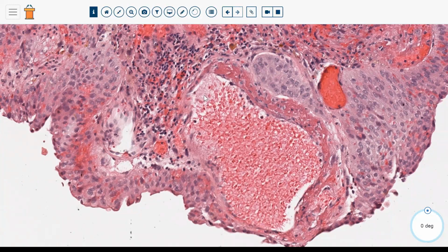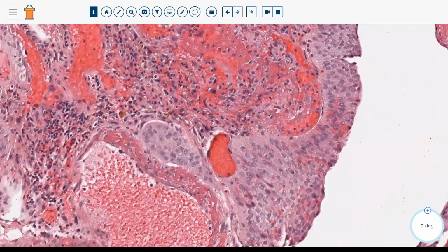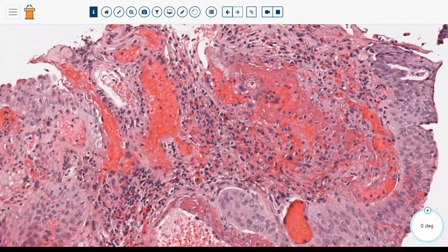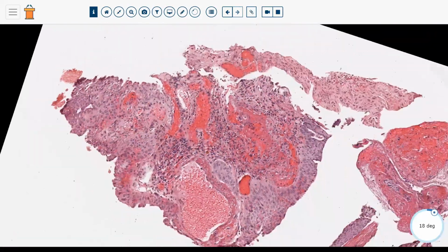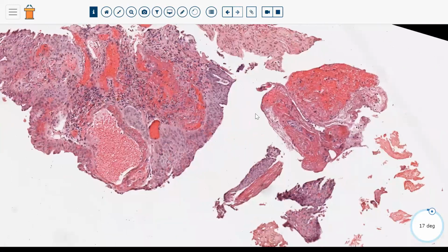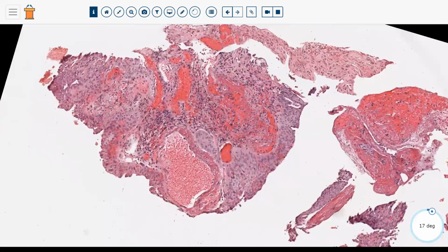And the clue that you're dealing with pseudocarcinomatous hyperplasia is that you often have this layer of fibrin around the epithelial cells and around the blood vessels. So here's a blood vessel, a dilated blood vessel, and you've got this layer of fibrin just outside of it in the wall. And over here, for example, you've got the epithelium, and then you also have this fibrin accumulation underneath. That is a clue that you're dealing with radiation cystitis or pseudocarcinomatous hyperplasia. Those two things basically go hand in hand.